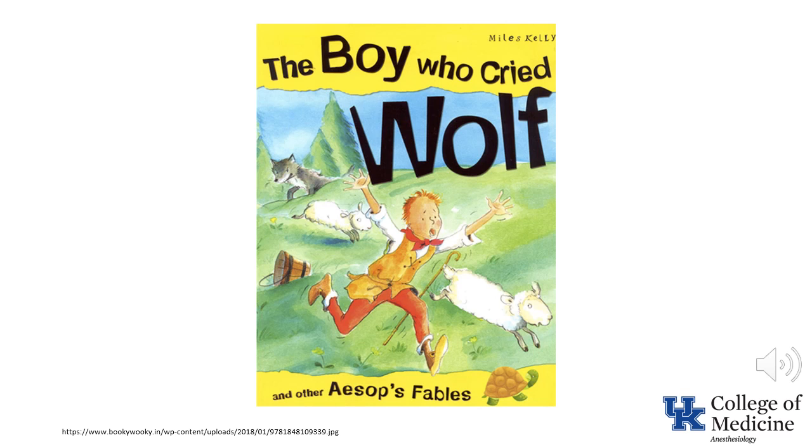Motion artifact is one of the leading causes of false alarms from pulse oximeters. Remember Aesop's fable about the boy who cried wolf? Alarm fatigue is a real problem. Think about your experience in the operating room. While you probably don't ignore a pulse oximeter alarm, can you honestly say you respond to every alarm from an infusion pump as aggressively?